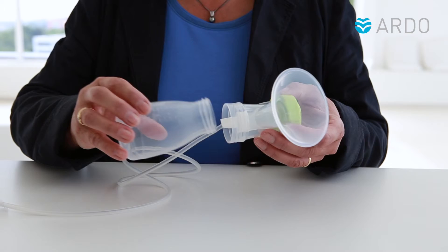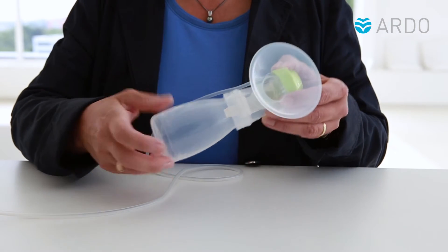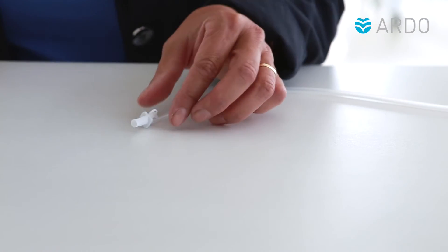Now screw the bottle to the breast shell. The pump set can now be connected to the Ardo Breast Pump.